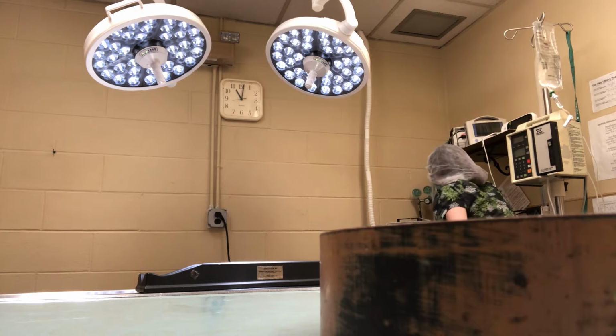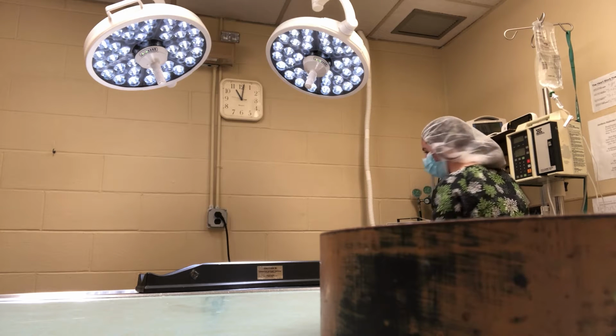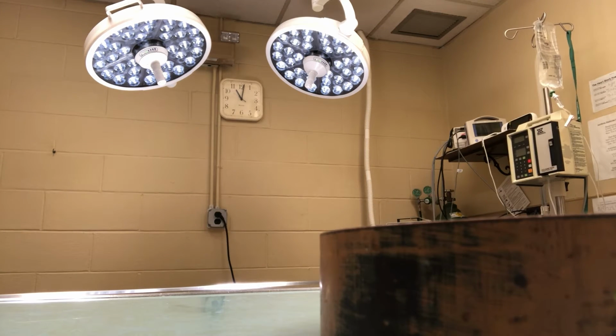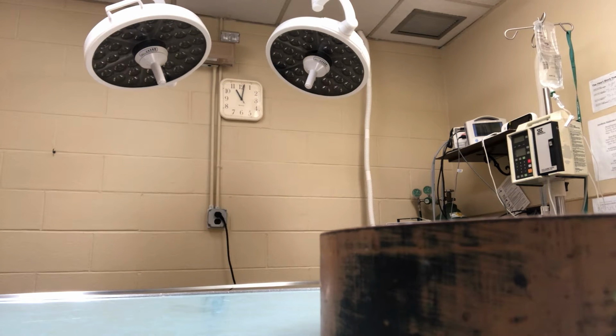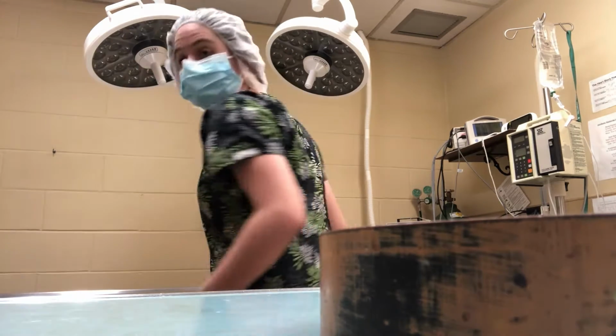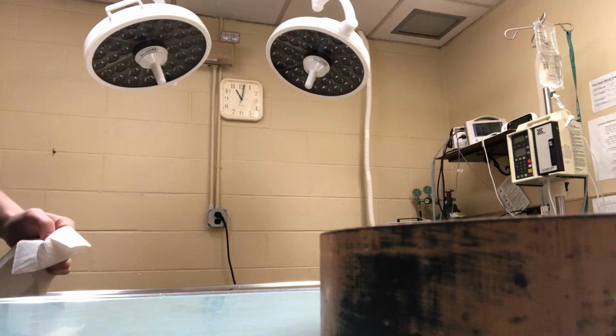Next, I want to make sure that our oxygen is completely off, our ISO is off, our scavenger is away, and then turn off our lights and our fan. And then next, I'm going to clean the surface of the table.